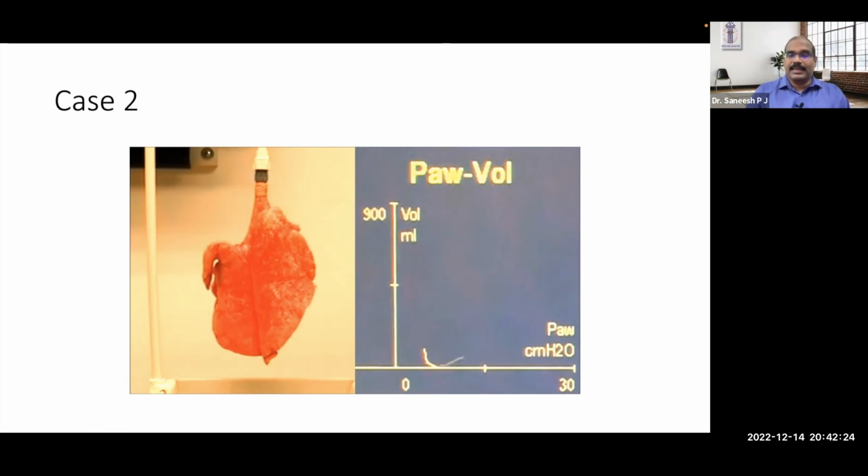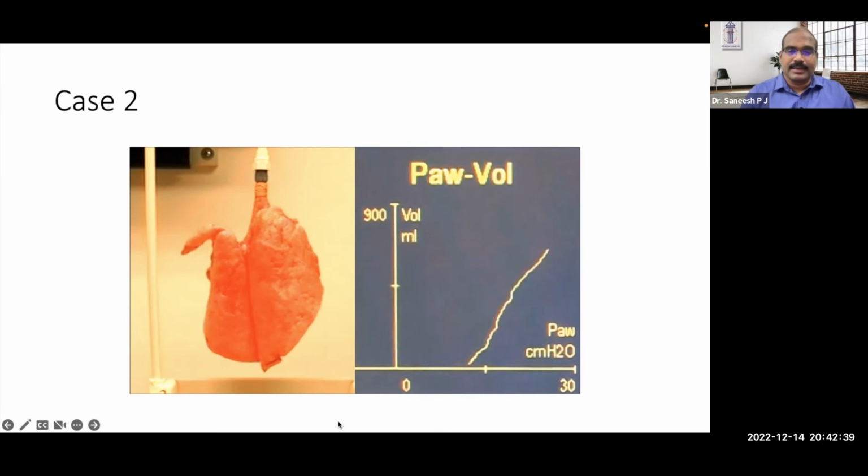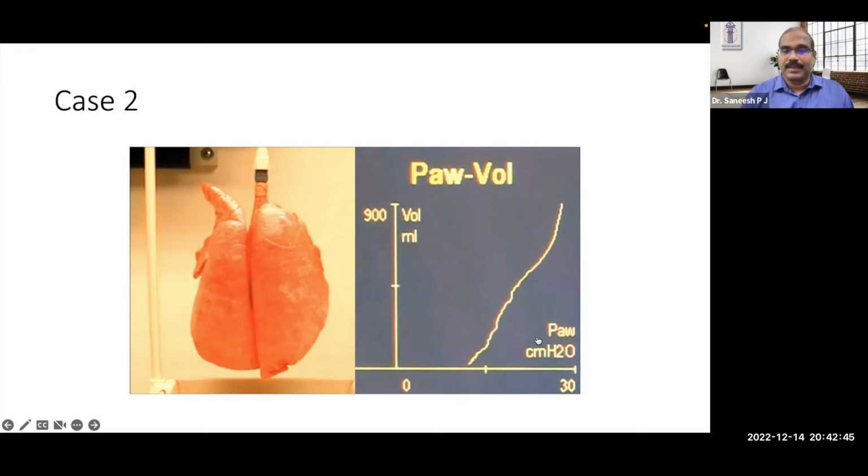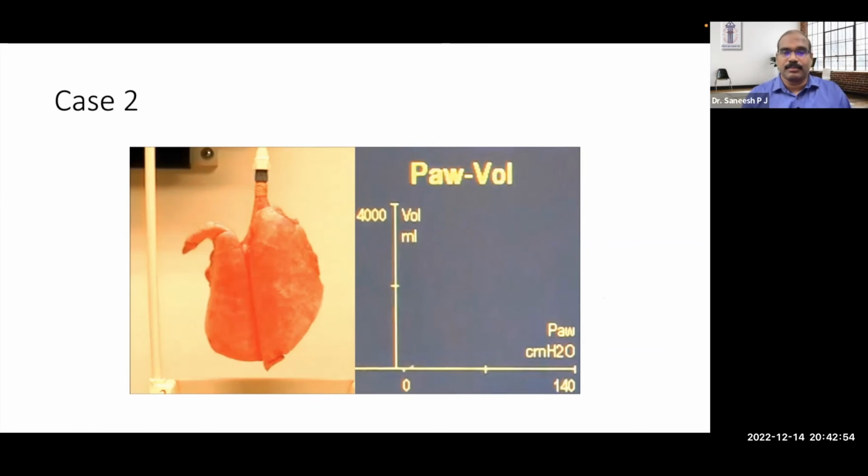So what is happening is, to generate a decent tidal volume of around 400, in this graph, the pressure generated is something close to 25. So here they are doing a recruitment. How to do recruitment properly, Dr. Anoop will say. Here you can see the airway pressure has gone up temporarily. And then after the recruitment, they'll resume ventilation.